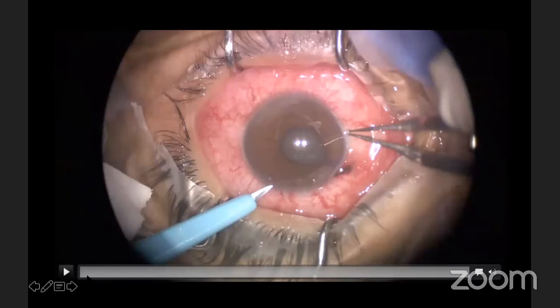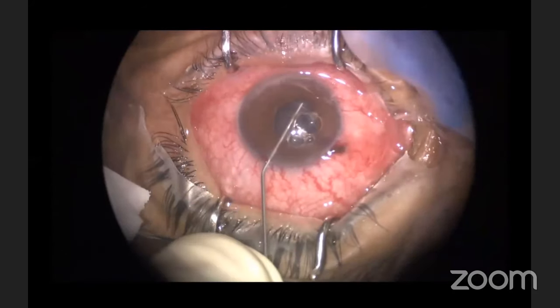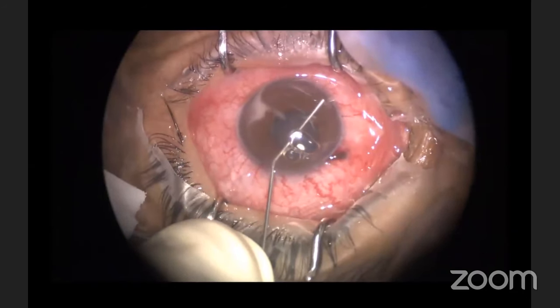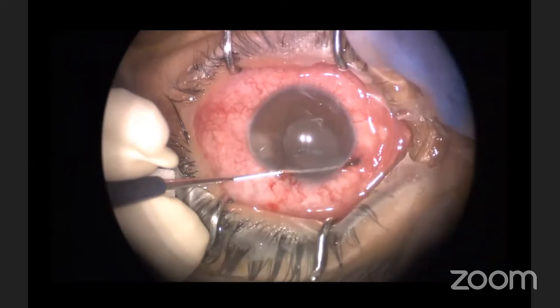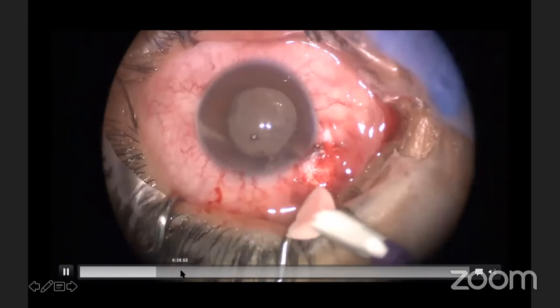This is a case who presented with endophthalmitis. You can see the limbal route of entry. The eye was full of pus. We attempted the iris reposition. So after resuturing the wound, the view was not that good because of the vitritis, but eventually we found the foreign body.